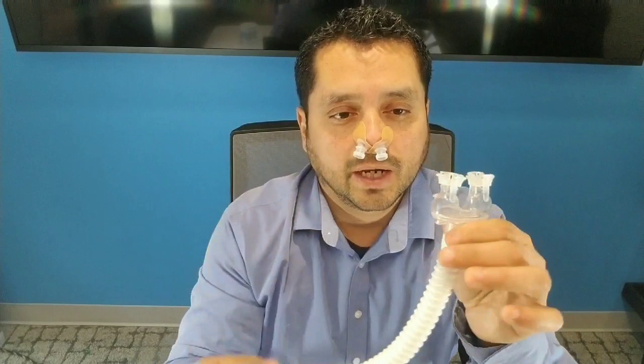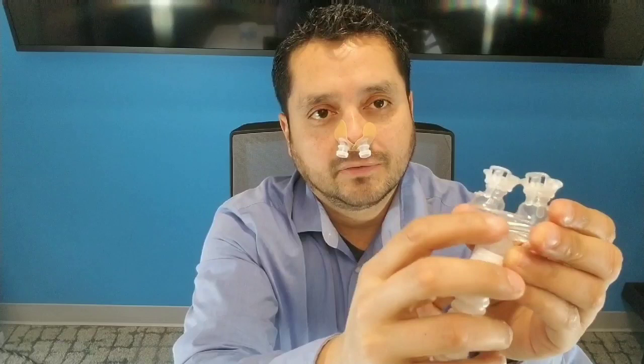Now that the ports are in position, you're going to take the Dreamway and make sure that it is aligned properly. There's writing in the front — you want to make sure it's facing forward and not at you, or it's going to be backwards. Let's squeeze one at a time and snap them right in.